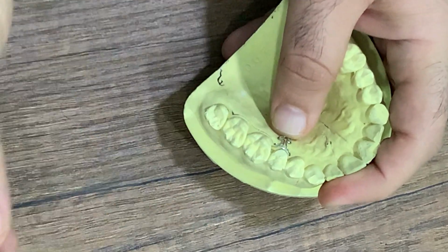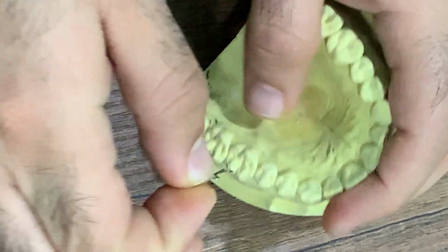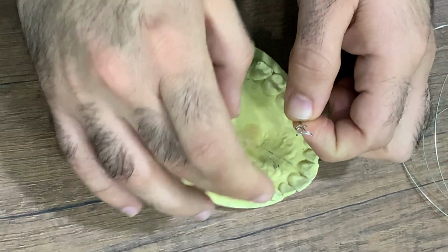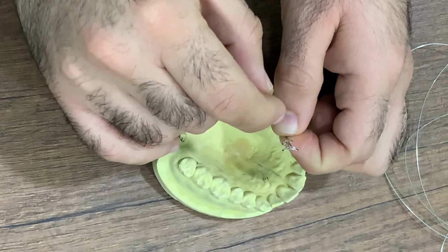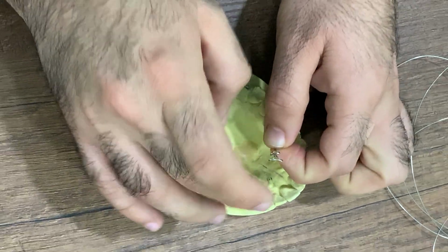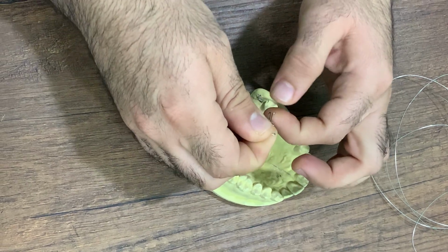Previously, you took Z spring, double Z springs, finger spring, and guarded finger spring, which are also palatally situated active components of removable orthodontic appliances. T-spring also is a palatally situated active component of removable orthodontic appliances.